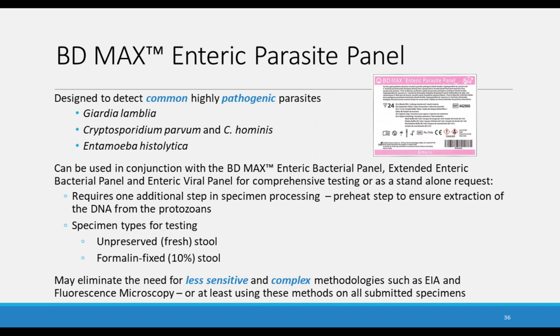You can use unpreserved stools for parasite exam and also formalin fixed. This has been very helpful, being able to use unpreserved stools. Even in the past, when we had adequate collection devices given to all of our clinicians for ova and parasite exams, it never failed that on weekly occasions, several times per week sometimes, we would receive a fresh stool for ova and parasite exam, manual exam, and we had to reject it due to its long transport time.